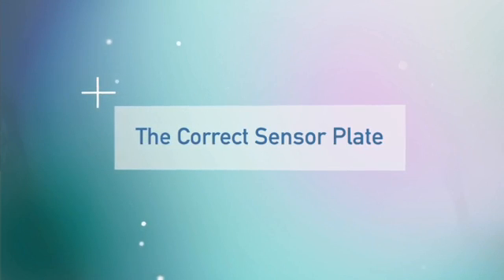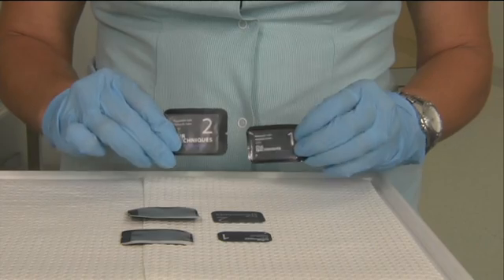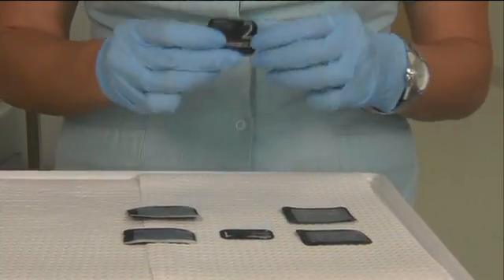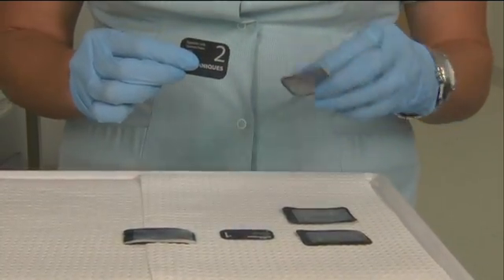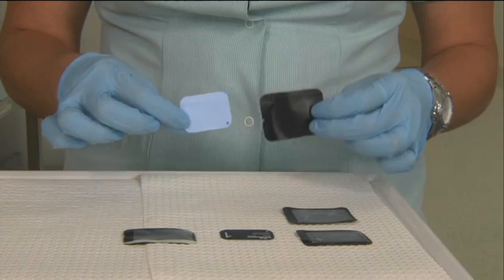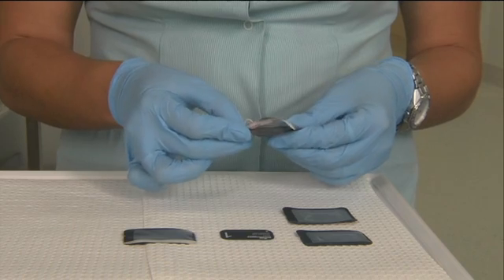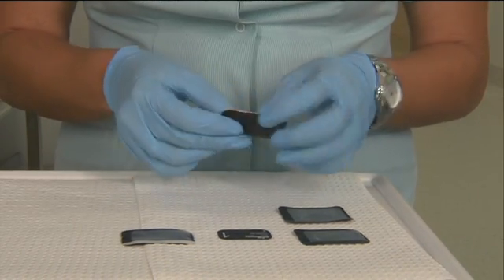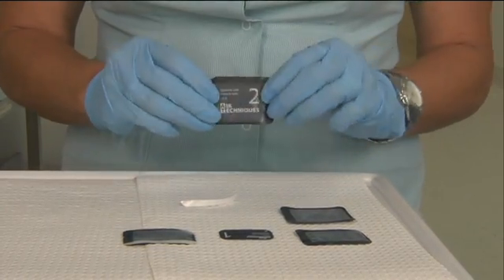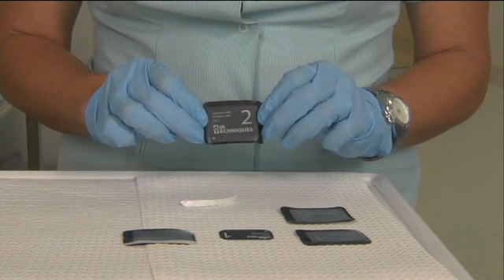We have two sizes of PSP or sensor plates. Size 2 is used for adults, and size 1 is used for children. We're now going to place our size 2 sensor plate within its protective sleeve. One side of the sensor plate is a lighter color — this is the photosensitive side of the plate, and it's always positioned towards the black or closed side of the sleeve. Jamel will then seal the top of the sleeve by removing the adhesive. The other side has a clear window, which reveals the necessary detail to orient our x-ray correctly.